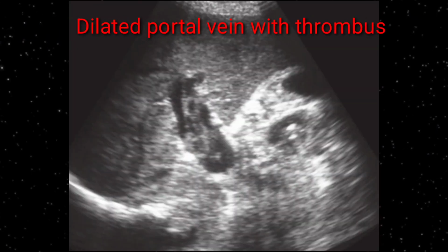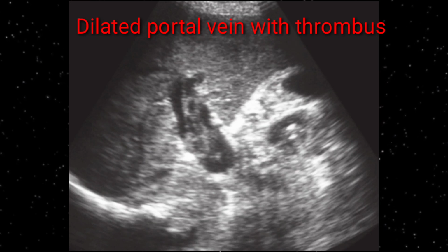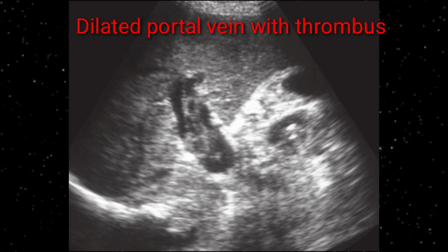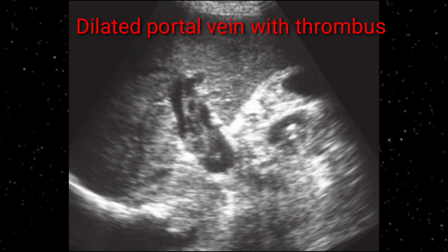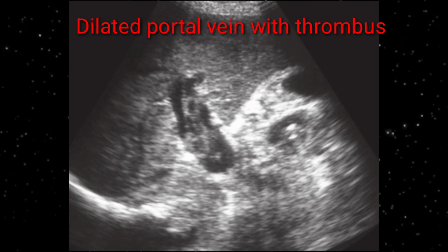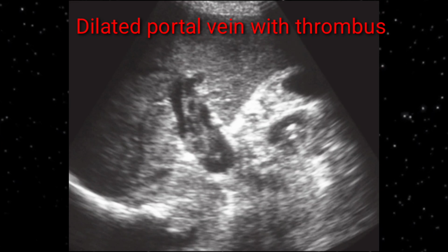Look at this image. The portal vein is dilated and an intraluminal echogenic thrombus is seen. Always watch for portal vein and intraluminal thrombosis in a cirrhotic patient. Although at an earlier stage there may not be thrombus, as the disease progresses there is a great chance of developing portal vein thrombosis. So it is important to look at the portal vein diameter. If it is enlarged, mention that the portal vein diameter is enlarged, and if there is any echogenic thrombus within it, mention that the portal vein is dilated and contains intraluminal thrombosis, which is a sign of a cirrhotic patient.